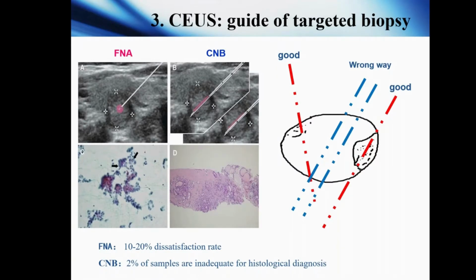Contrast enhanced ultrasound can also be used to guide targeted biopsy of thyroid nodules, which could improve the satisfaction rate of samples.